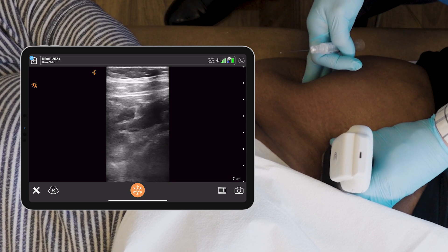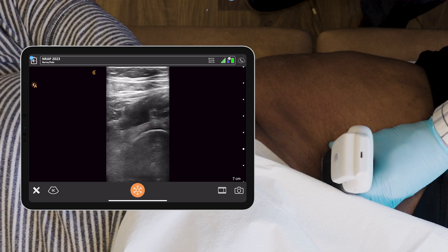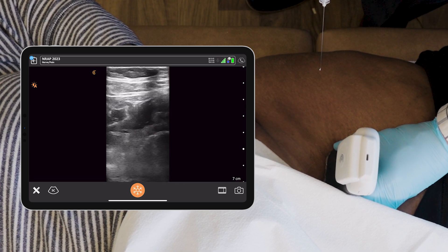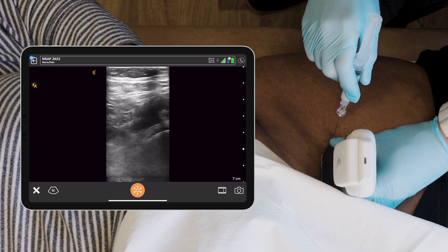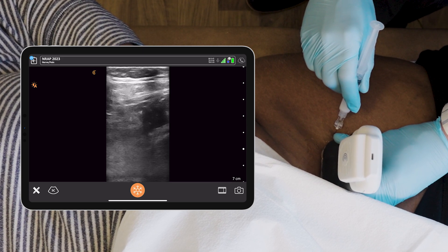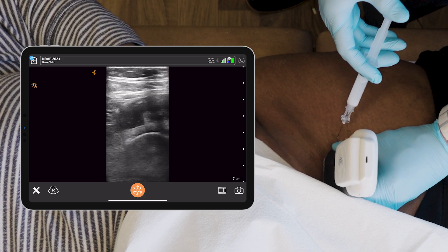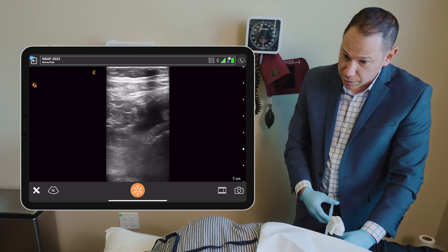I already prepped with chlorhexidine. I'm going to target the head of the femur underneath the capsule using a 25-gauge three-and-a-half-inch spinal needle. A little pinch, my dear. And I'm working my way in — and right here, I landed on the bone.